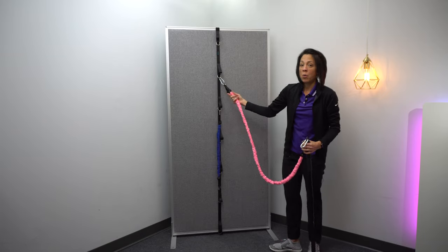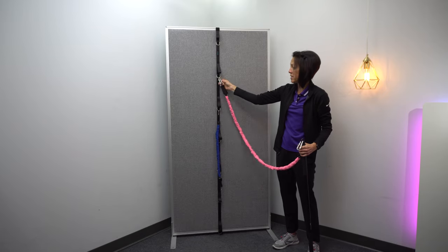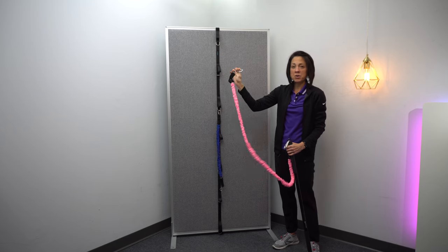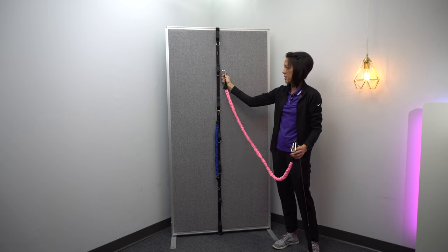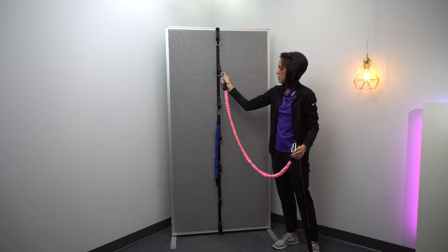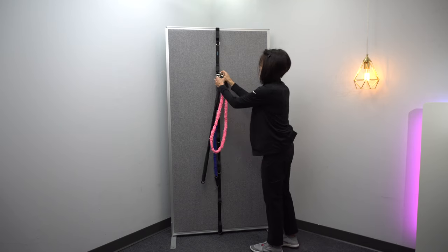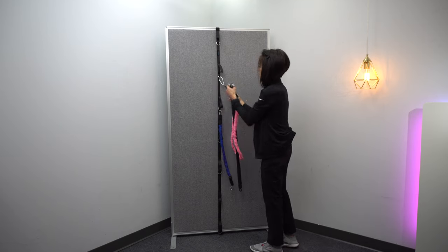One of the nice things about it is it has these loops, or it has these hooks — metal hooks — so that you can just hook the regular resistance bands to it. Just like that.